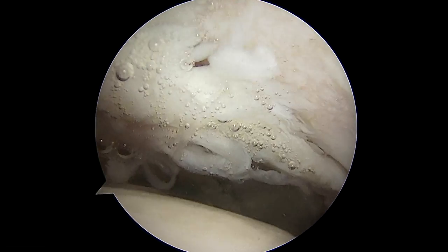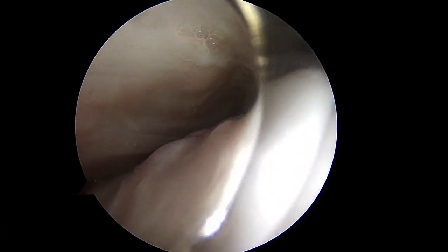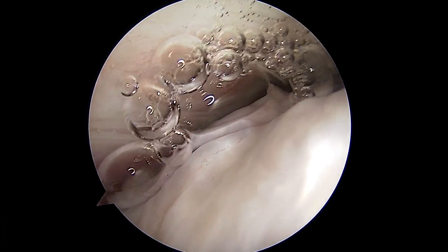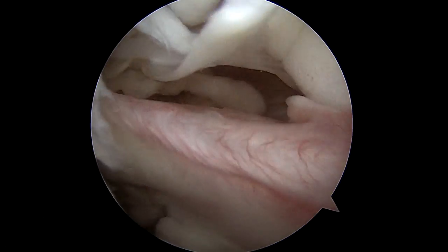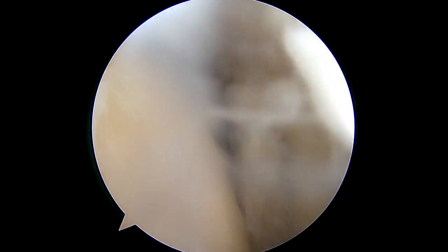Here you can see he's getting an acromion humeral fulcrum. He's getting adaptive changes on his greater tuberosity and it looks like his cuff is going to be scarred in up against the acromion. His articular surfaces are reasonable — certainly at age 56 you don't want to be doing a reverse total shoulder on him.